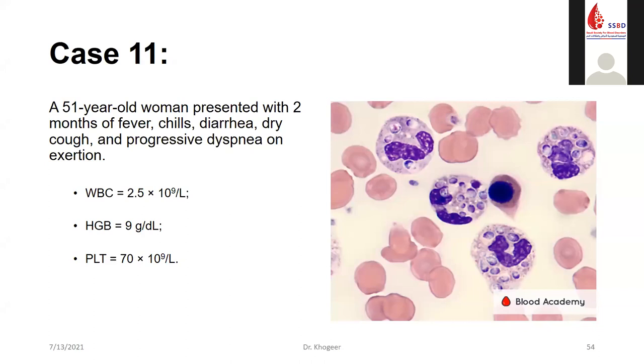This is why in the report, some pathologists use reactive/atypical lymphocyte rather than using atypical only, because it will make the clinician a little bit confused. I prefer that if you want to use reactive alone, it's fine. If you want to use atypical also, just put reactive/atypical lymphocyte. But if you want to say this is an abnormal lymphocyte, you can say atypical or abnormal atypical lymphocyte.